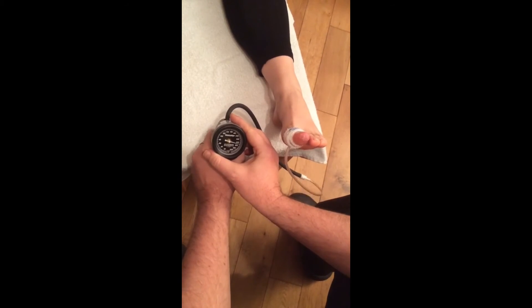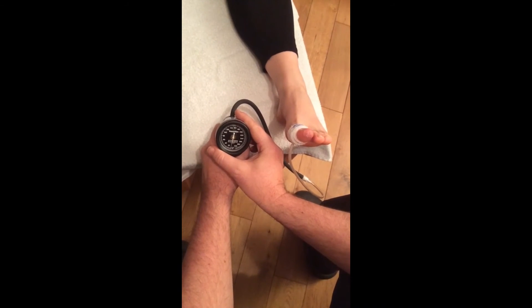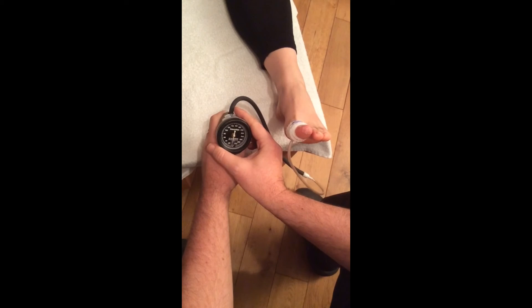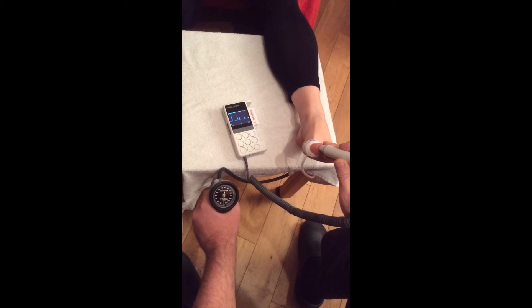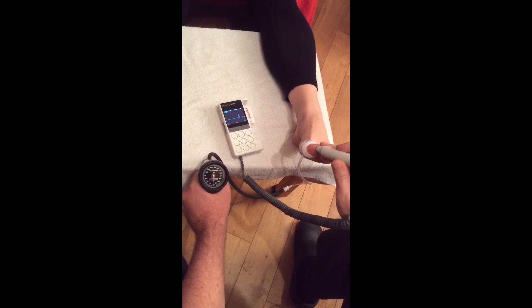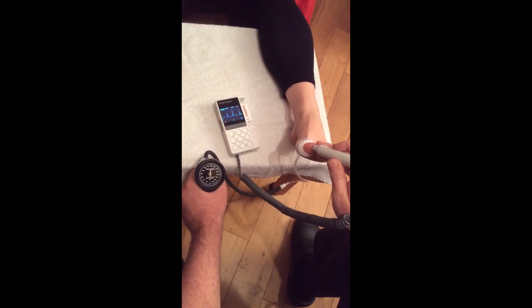If we're too erratic on the trigger we get movements like that. Place the tip of the 8MHz probe over the end of the big toe, anchoring next to it with one of your own fingers. Use plenty of gel.